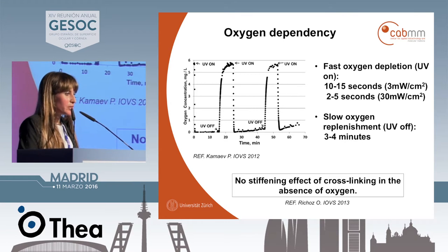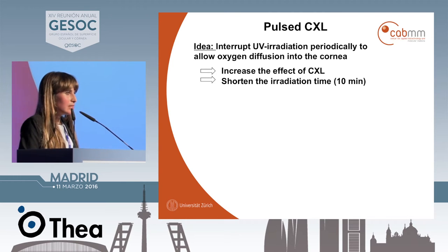Kamaev et al. showed a very fast oxygen depletion once the UV light is turned on. So within 10 to 15 seconds, there is no oxygen available. And with higher irradiances, even faster. And the oxygen replenishment, however, is only very slow. It takes 3 to 4 minutes. Another study has also shown no stiffening effect of the cross-linking in the absence of oxygen. So this strong oxygen dependency has led to the modification of the cross-linking protocols.